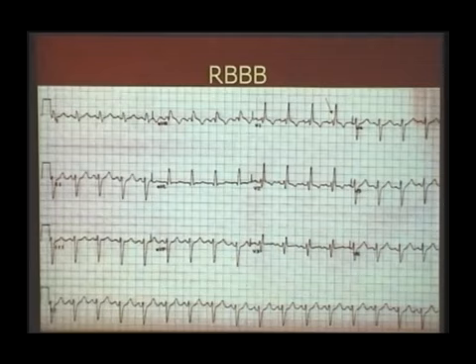Then we must see where the terminal vector is coming. If the terminal vector is coming towards the right side, it is a right bundle branch block. You see it here in V1: the terminal vector is delayed, slurred and positive. So whenever the QRS is widened and there is a terminal delayed slurred positivity in V1, it is right bundle branch block. Terminal delayed slurred negativity in V5, V6 is also right bundle branch block.